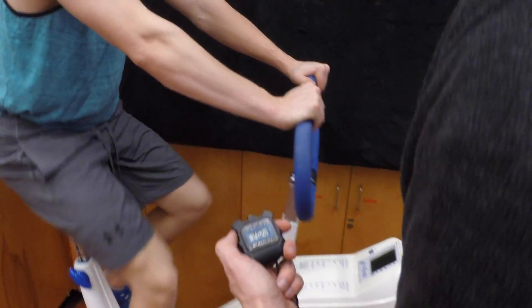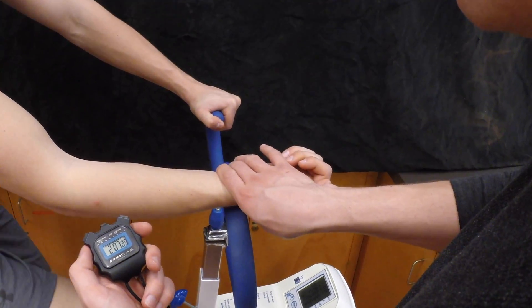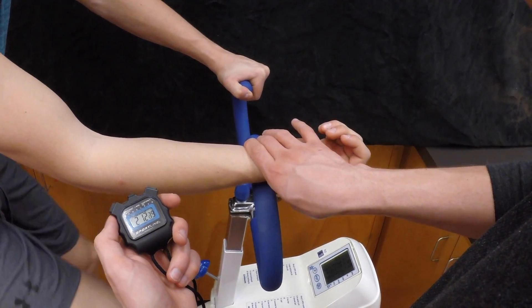After 2 minutes, take their heart rate. If it's not within 125 to 170 beats per minute, reset the timer and adjust the ergometer resistance accordingly. You've essentially started over.